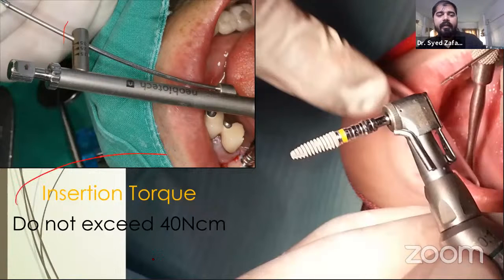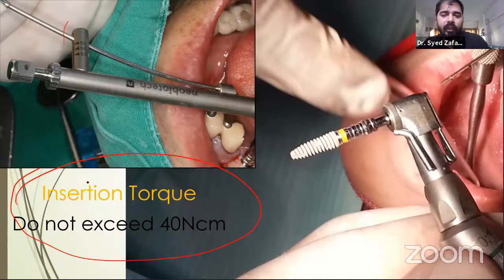Ideally, guidelines recommend not exceeding 40 Newton centimeters. Sometimes we place an implant at almost 80 and we are happy: oh, we have achieved so much torque. We achieve 80 Newton torque. No, this is not a good thing. There will be microfracture, there will be necrosis, and eventually the implant will fail.